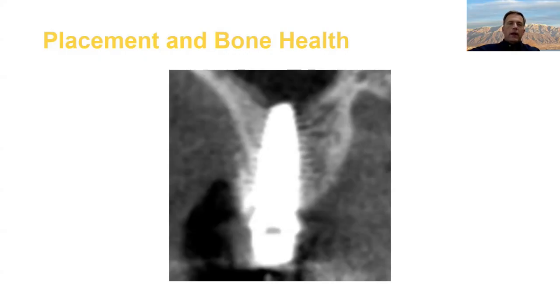nice blood flow. Like you see in this image here, when we get too close, when we don't leave enough bone around, it's like we're strangling the blood supply, and we can expect to see bone loss in those areas most of the time. And this is how you decide what's too big an implant.